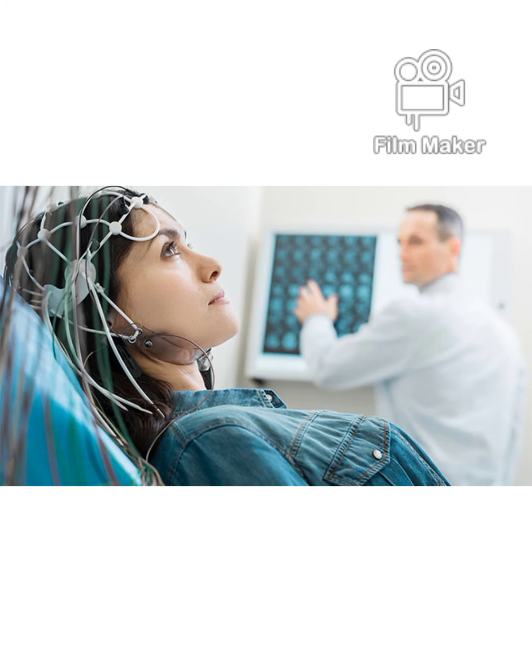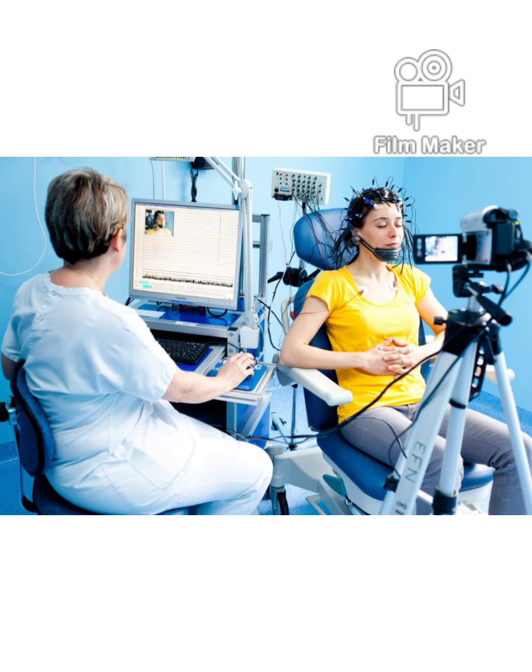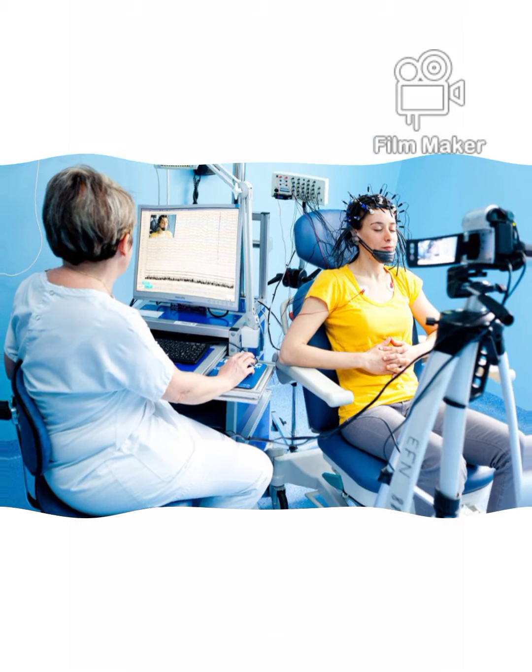And the process can be recorded by attaching the electrodes, as we have seen already on the screen, which consist of small metal discs with thin wires pasted onto your scalp over your head, so that those metal discs, which are called electrodes, can simply and clearly show your brain activities, whatever is happening inside your brain, directly on the computer screen, or it can be printed out on paper.